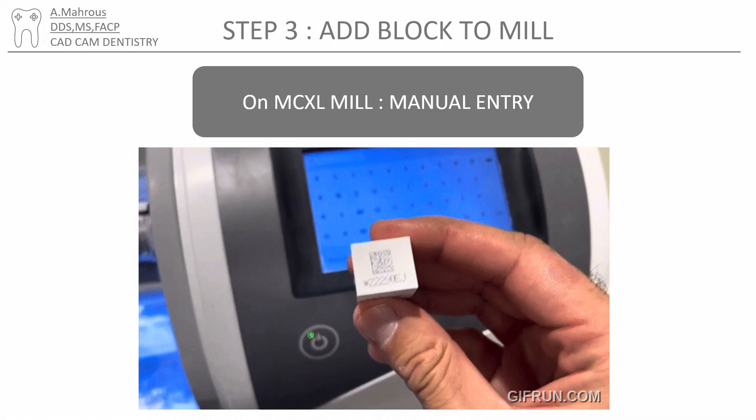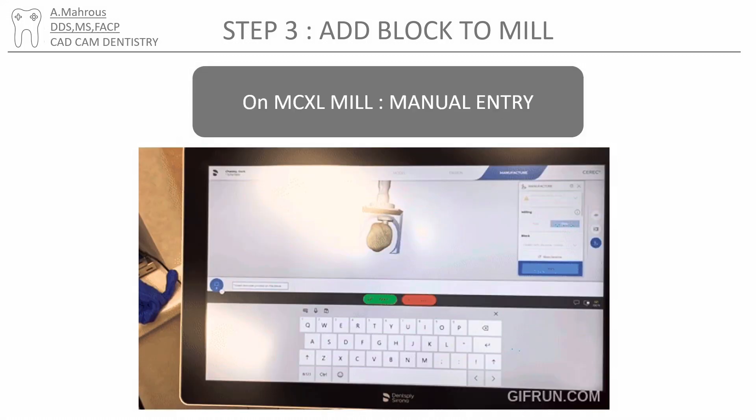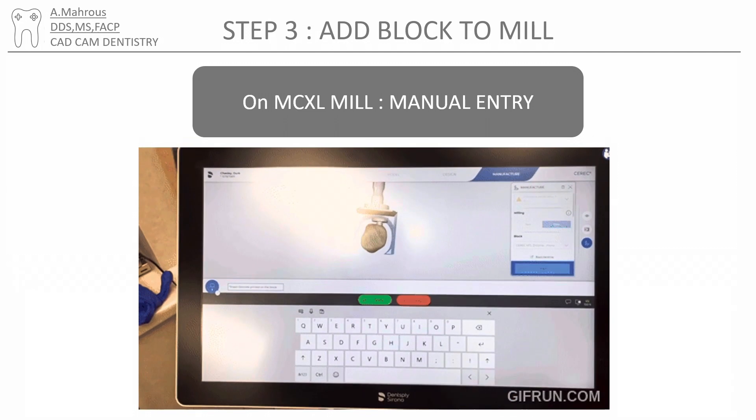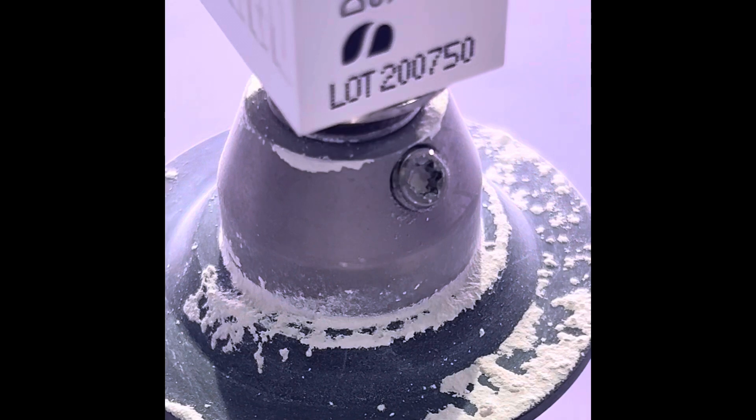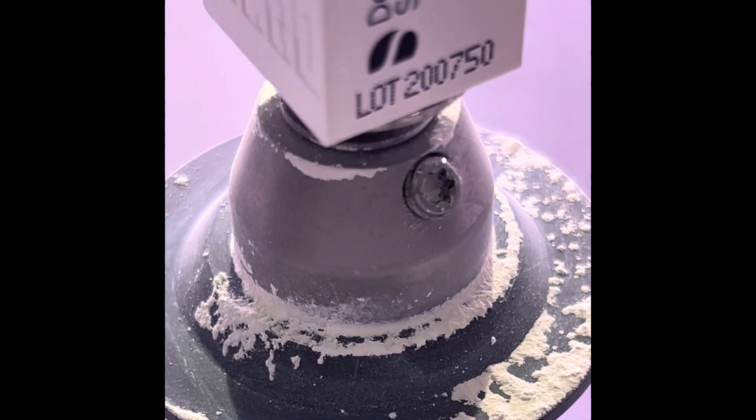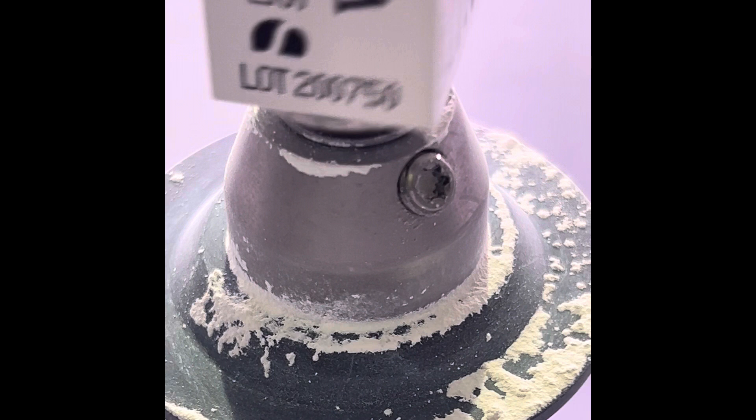However, for older MCXL mills, this involves typing in the code yourself on the machine or on the scanner. It's also important to make sure the block is fully seated. Notice how there's a space now between the block and the mandrel — it's important to make sure the block is fully seated as such.